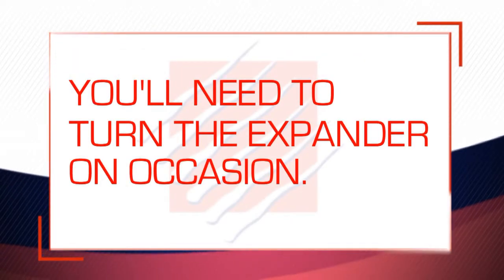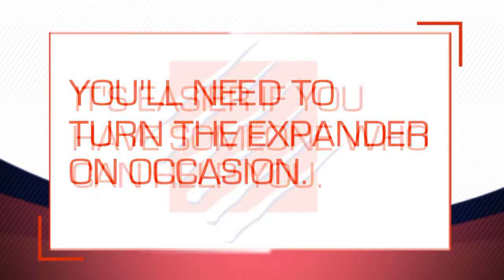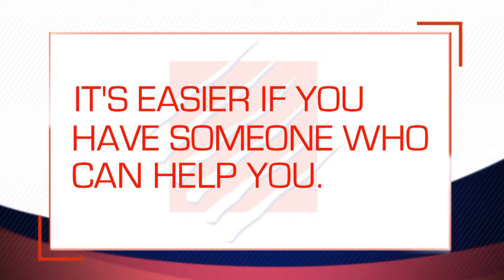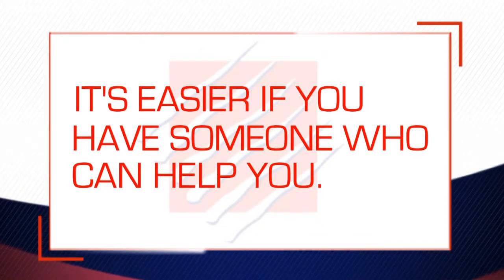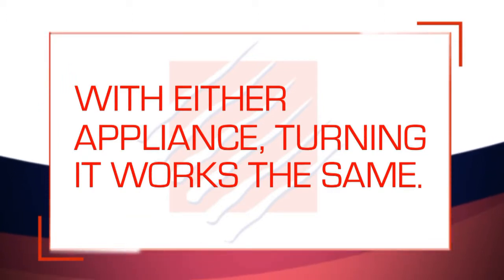As you've been told, you'll need to turn the appliance on occasion. Turning it yourself can be kind of difficult sometimes, but if you have someone who can help you, it's actually very quick and easy. With either appliance, turning it works just the same. Here's how to do it.